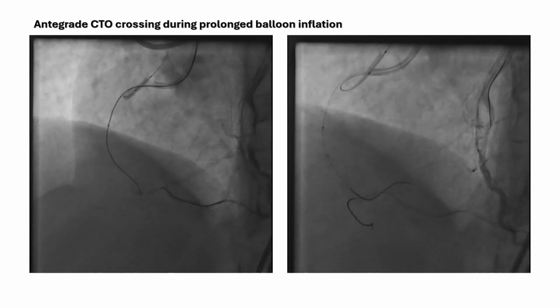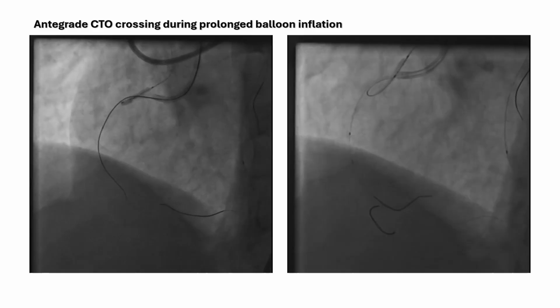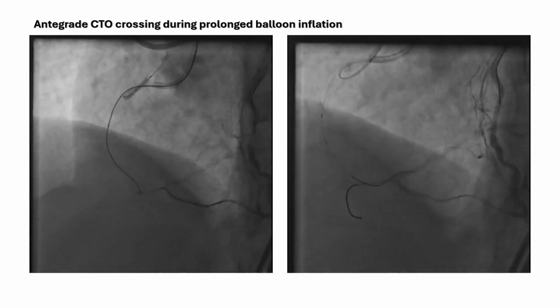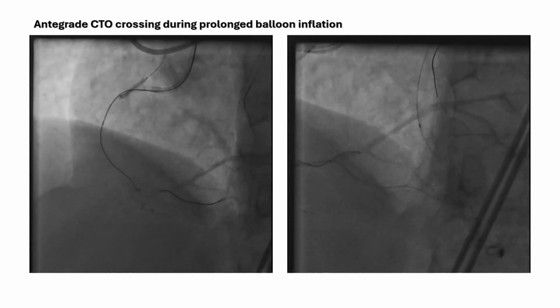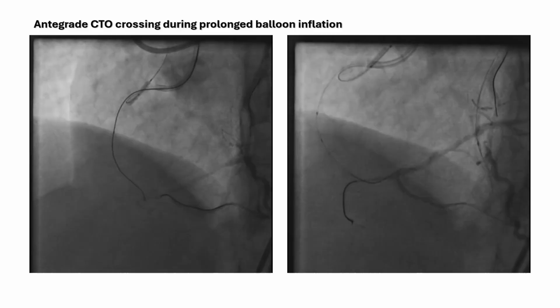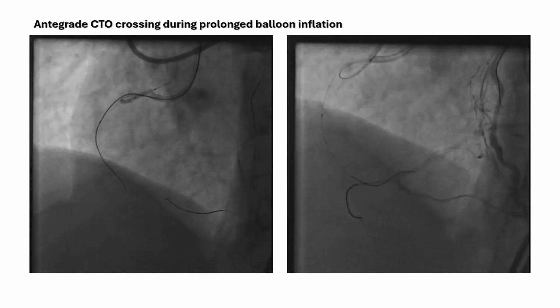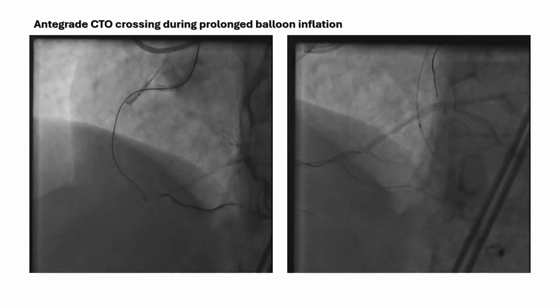We decided to proceed with the CTO procedure with an antegrade approach while performing prolonged balloon dilatation in the septal perforated artery. At this time, the patient has not yet experienced any hemodynamic or clinical problems.